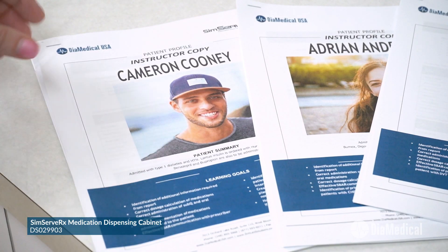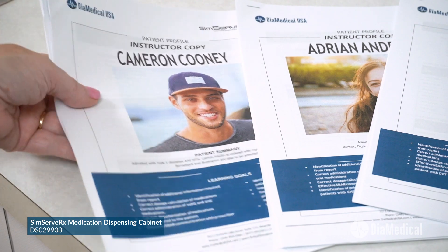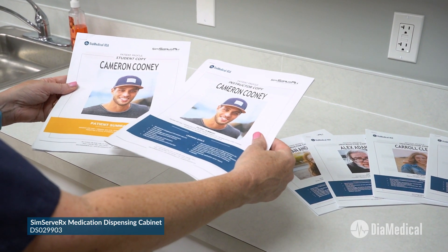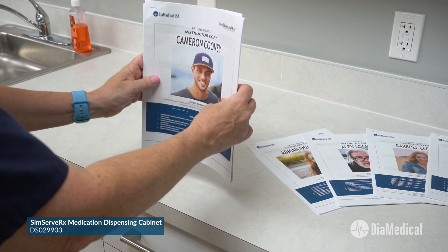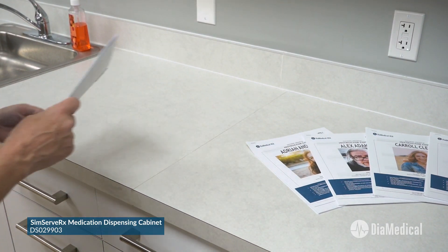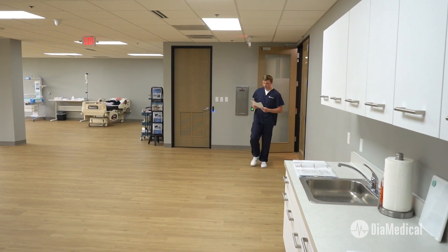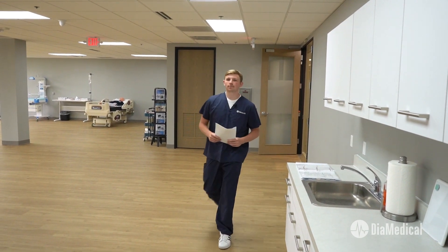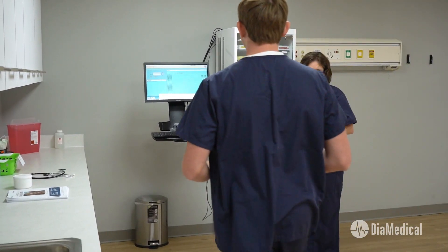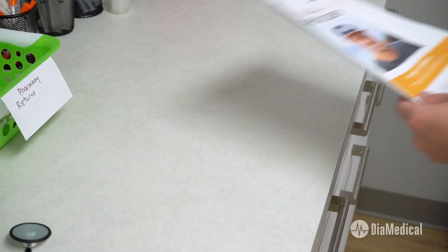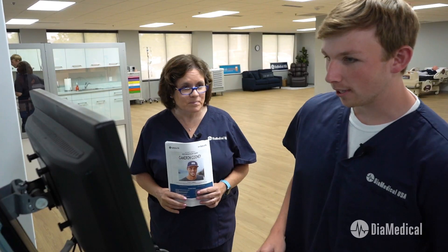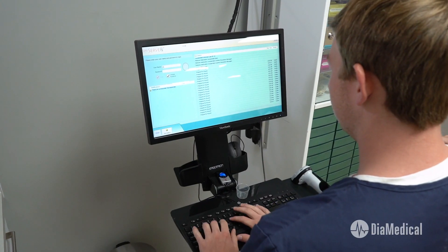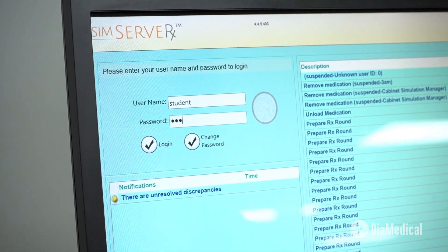Follow along as I demonstrate morning med dispensing with a student in one of our SimServeRx patient profiles. Ready to give meds to Cameron Cooney? Yep, I'm all set. Okay, go ahead and log on in and we'll pull up the MAR.